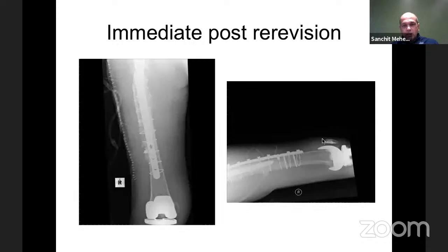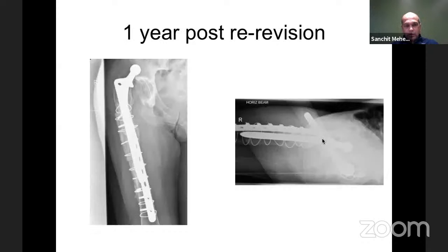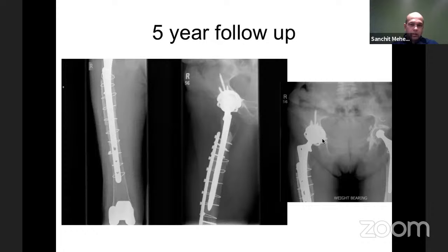Because there's a distal knee replacement, your choice is limited. You can't go any longer. You could go with a tumor prosthesis and put some cement in, but then there is a risk of a further periprosthetic fracture at the junction of the knee and the hip. So this time the option was to revise the stem and fix it with a plate, with cables and an allograft. With that, we had some success, but then had a dislocation, which meant we had to go on to a constrained hip replacement. So this is 5 years down the line from when this whole saga started. This patient finally has a functioning hip, but has had to go through a lot of surgery. Thankfully, did not get infected.